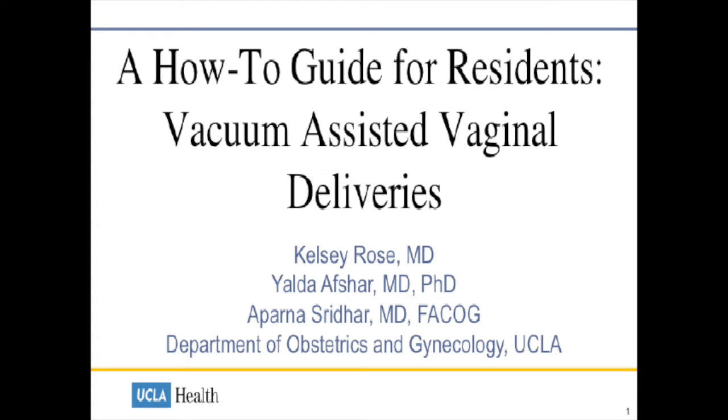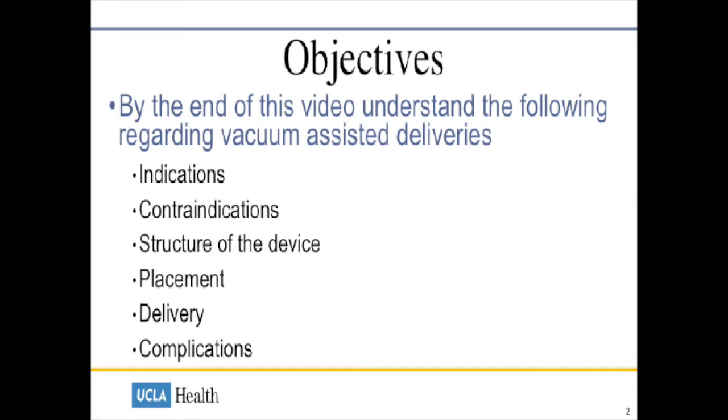How-to guide for residents: vacuum-assisted vaginal deliveries. By the end of this video, you should understand the following regarding vacuum-assisted deliveries: indications, contraindications, structure of the device, how to place the vacuum, how to use the vacuum for the actual delivery of the fetal head, and complications.